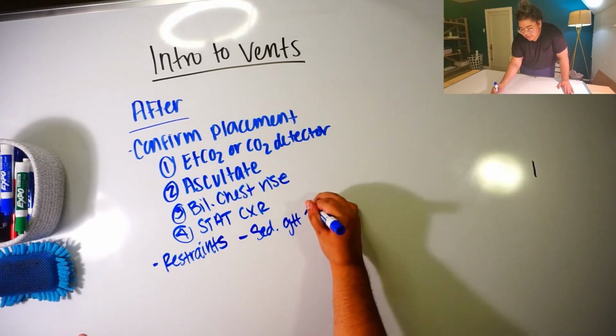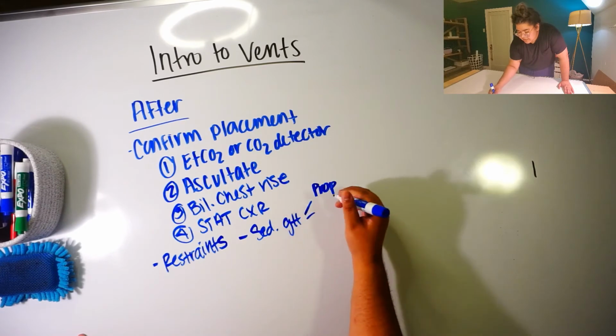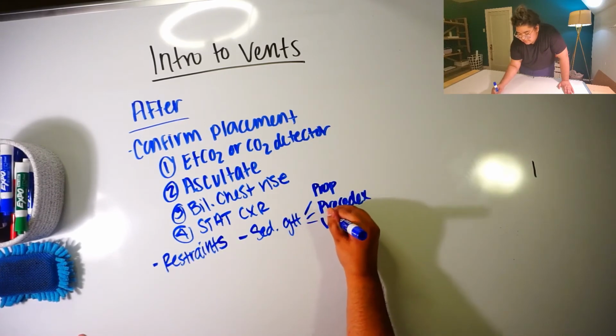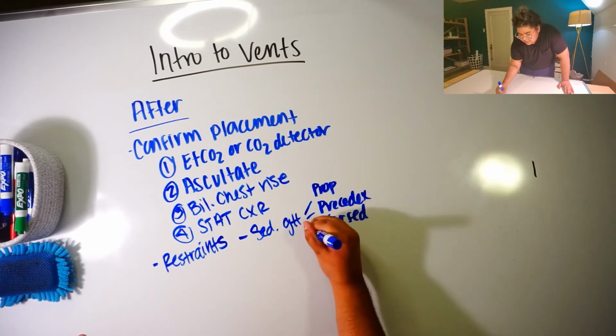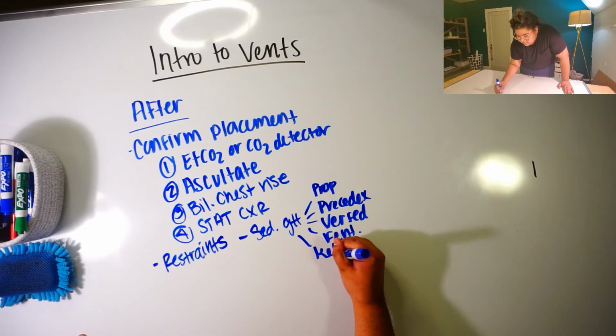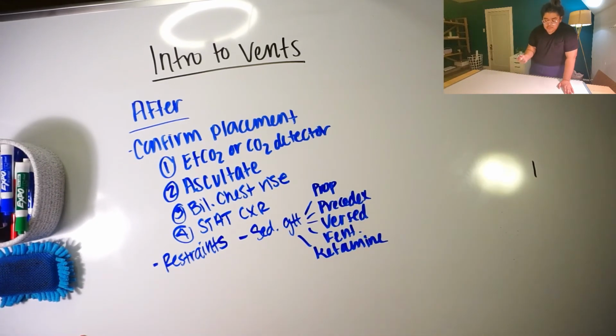Other thing we're going to need is a sedative drip. Okay, so at my facility, options are propofol, love that drug, Precedex, Versed, fentanyl, and ketamine. Okay, so one of those or multiple of those can be used.